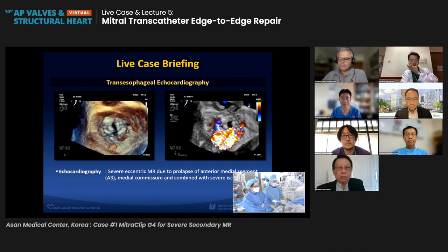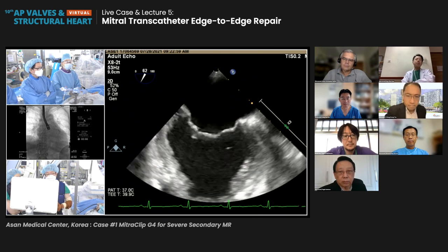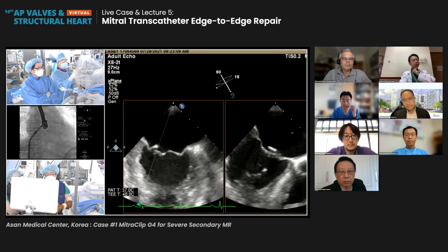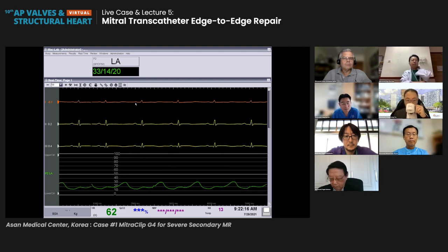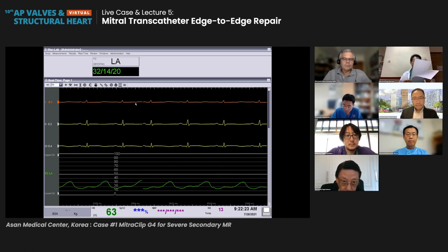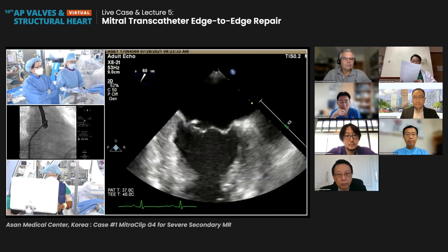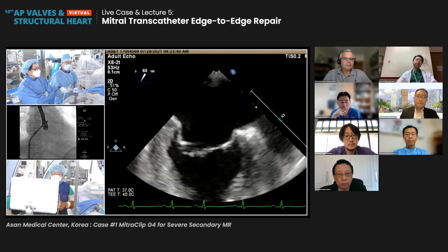Thank you for your great opinions. Now we did the septal puncture at the posterior and superior position. It was a little bit hard to find a good septal puncture position. After the septal puncture, we checked the LA pressure. You can see the prominent V wave with peak LA pressure 32 and average 20. Now we are in the LA. We advanced the steerable guide catheter, and as planned, we inserted the NTW system into the LA. Then I will begin my procedure.